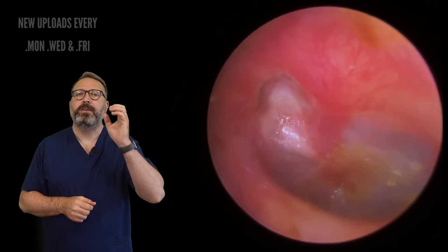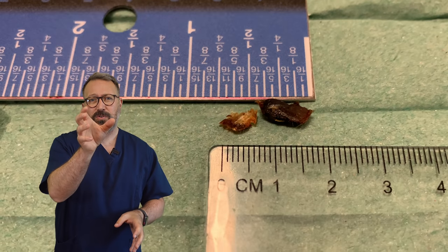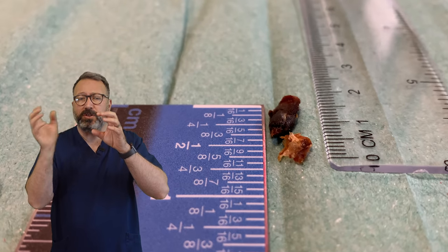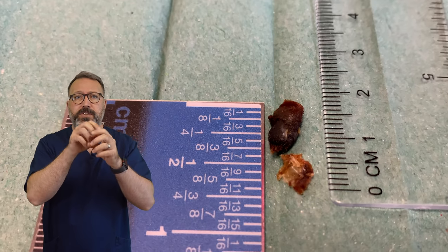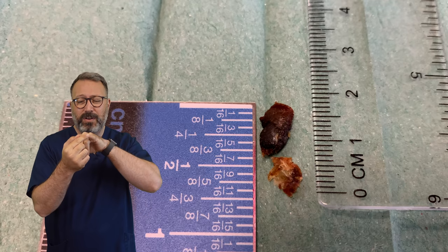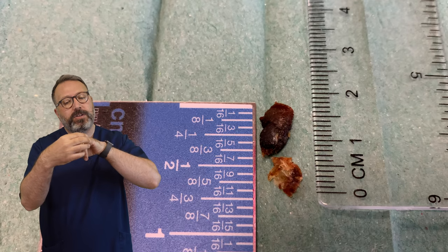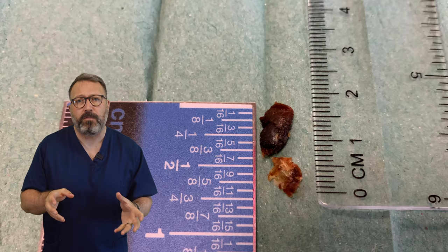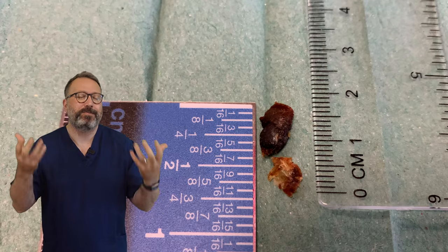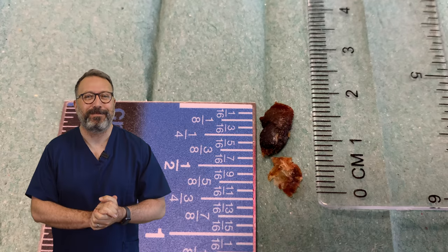Oh my goodness, this patient was so, so relieved to get that out. You can see there — about two centimetres, three quarters of an inch. The section to the left-hand side was the skin, and the darker piece was the actual wax plug itself. Now don't forget, your eardrum is about the size of the tip of your little finger — I know everyone's looking at their little finger now — but that's how big it is. So imagine that pressed up against that section. Really uncomfortable, really blocking things out. This patient could hear so much better — they felt they had superhuman hearing, which is quite normal following a wax removal. And then it tends to go back to normal again about an hour later.